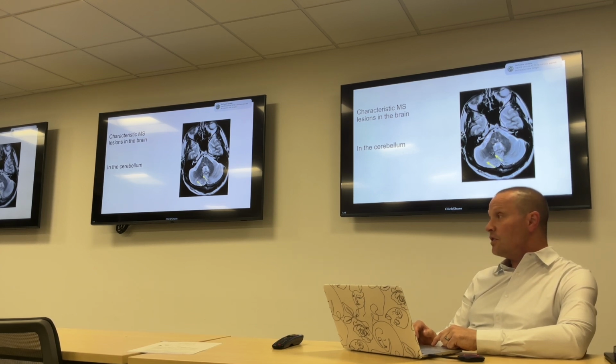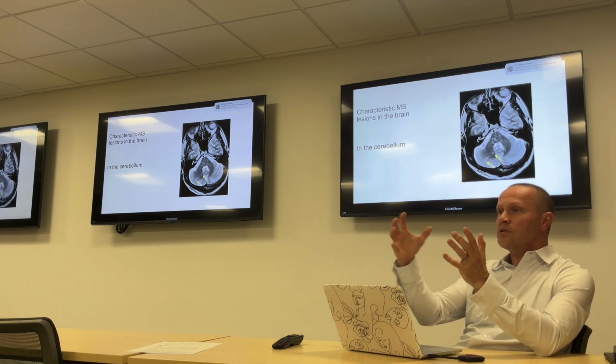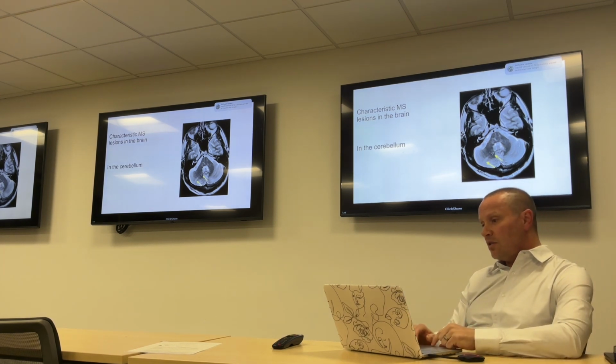It can be confusing. Sometimes you get artifact, and artifact can come from different things. Sometimes the patient will move a little bit on the scanner. That causes these sorts of shadows and echoes that can be confusing. They can mix you up. You can see here this patient's eyes are moving, so it looks blurrier, not as crisp.